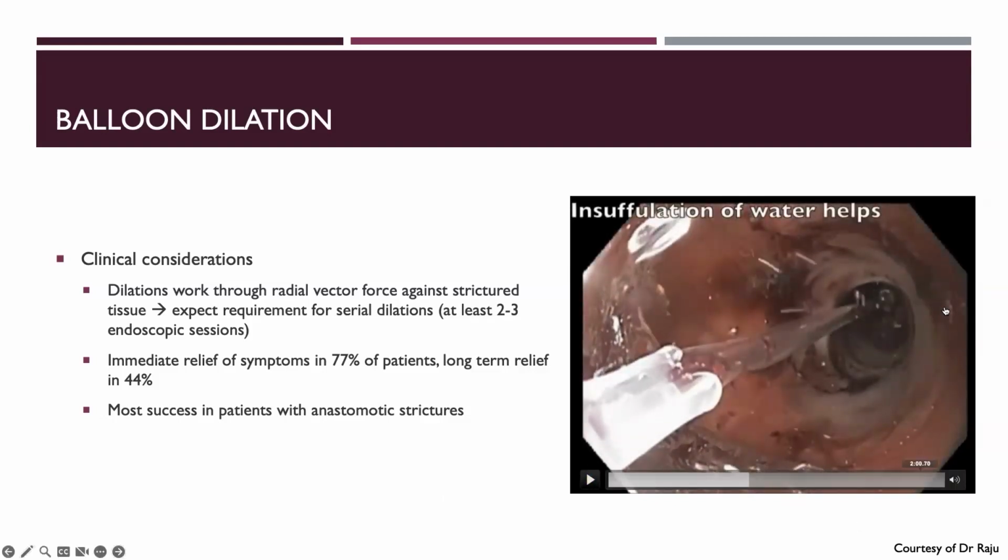I'm going to stop right here. And you can see that the force of the balloon is the highest in the center. You can see wide out of the area that it's applying this radial vector force against. And to see into the balloon and observe your dilation, you actually want to bring the balloon as close to the face of the scope as possible. Then you want to rotate the scope with your right hand inwards a little bit, so towards the left. And then you want to push your dials in. So big dial back, little dial back as well. So you're looking into the balloon.